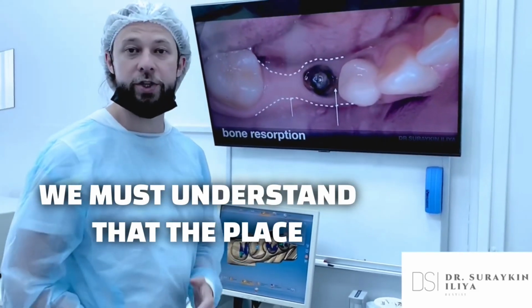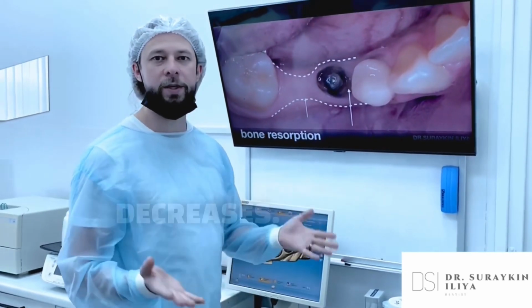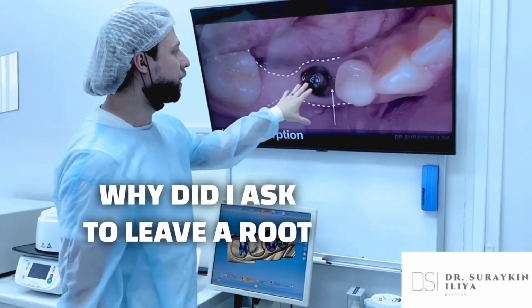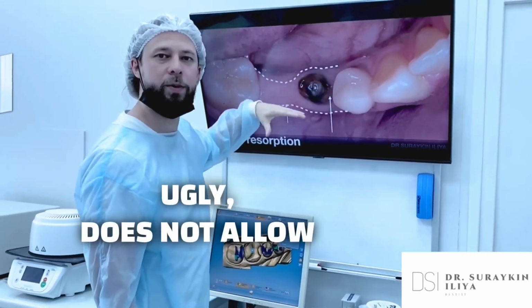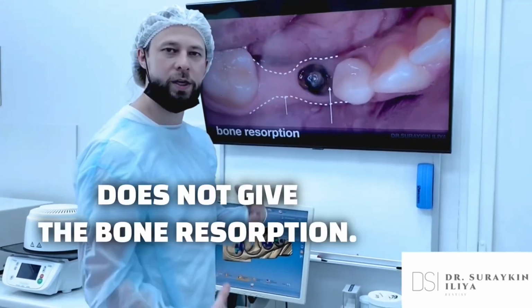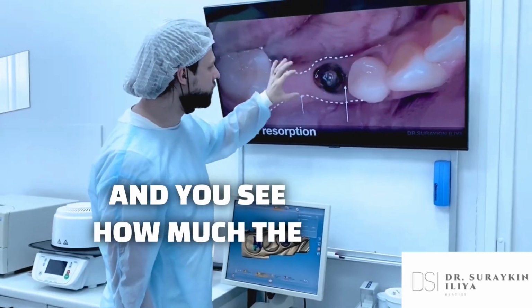We must understand that the place where the tooth is removed, the tooth is absent. Over time, the bone tissue decreases. It decreases in thickness and height. Why did I ask to leave a root here? Even a small tooth, no matter how beautiful or ugly, does not allow the bone to decrease in size, does not give the bone resorption. There is no root here. And you see how much the bone has disappeared.